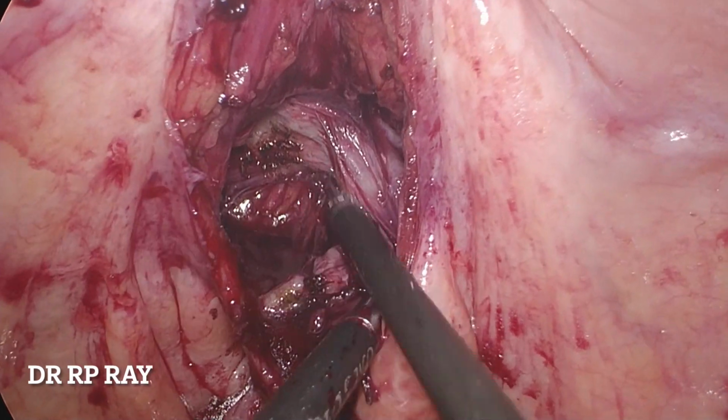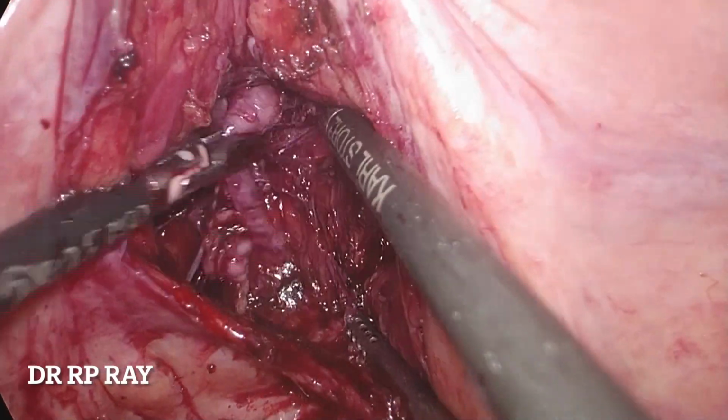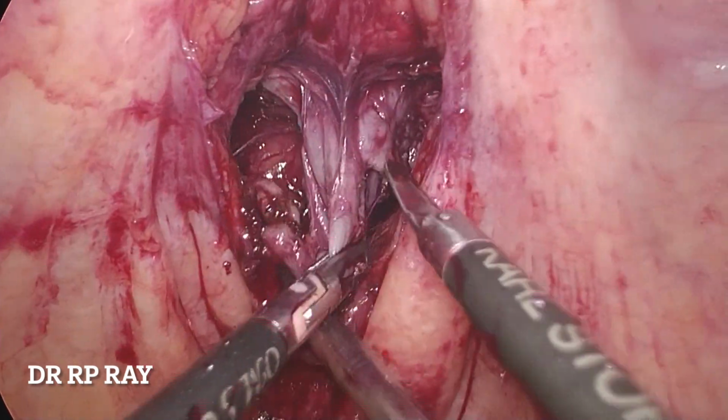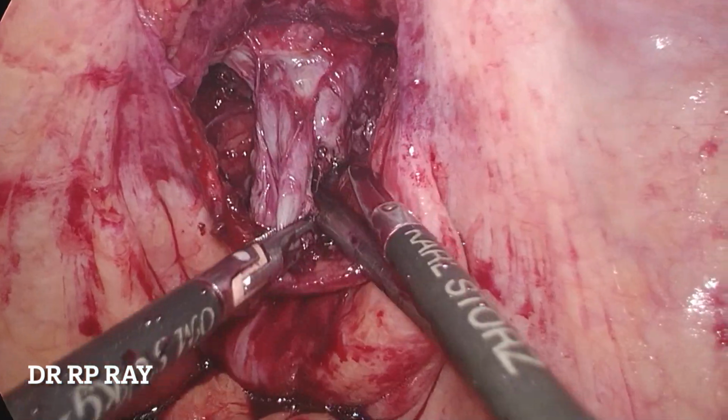But some suggest that complete removal of the seminal vesicle is necessary, and there are reports of seminal vesicle cyst from the remnant seminal vesicle after radical prostatectomy.